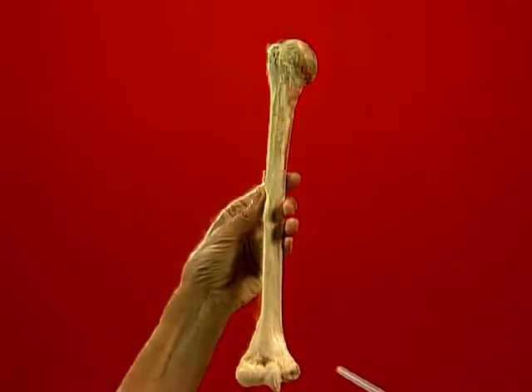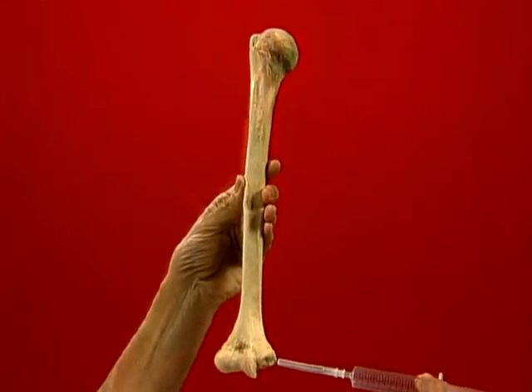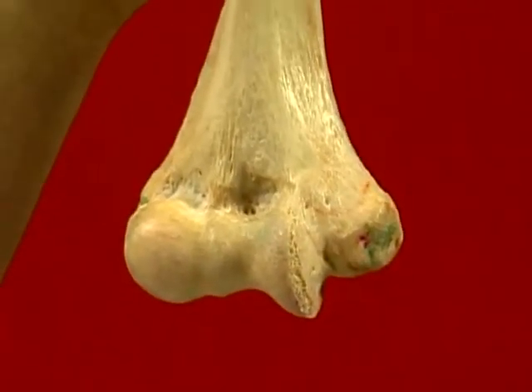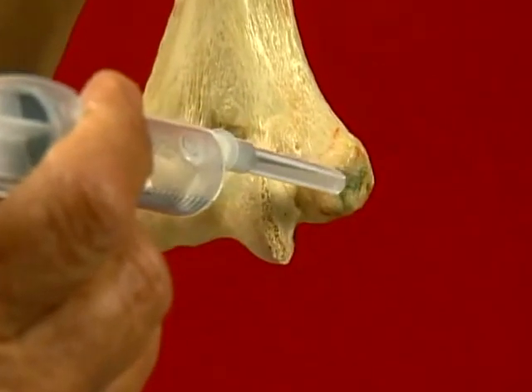The tendon arises from the facet lying immediately in front of the medial epicondyle. The needle is inserted just anterior to the facet and passes down to touch bone. The solution is peppered into the enthesis.